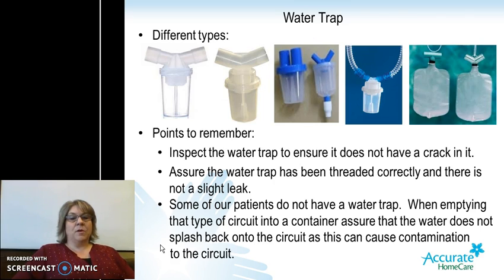Some points to remember. Be sure to inspect the water trap to ensure it does not have a crack in it. You also want to ensure the water trap has been threaded correctly and that there is not a slight leak. Some of our patients do not have a water trap. When emptying that type of circuit into a container, assure that the water does not splash back onto the circuit, as this can cause contamination to the circuit. Most of our clients do have water traps in line. We do have some that do not, but as a rule, we do utilize the water trap.